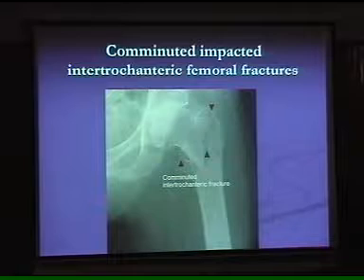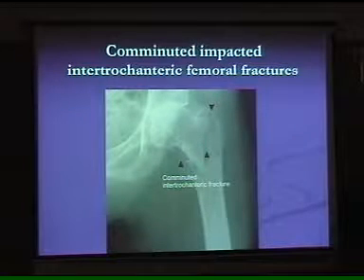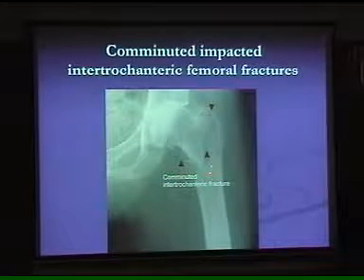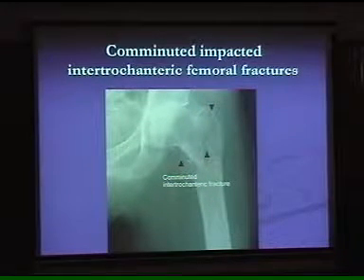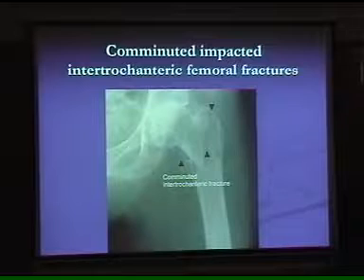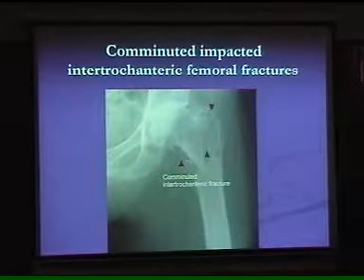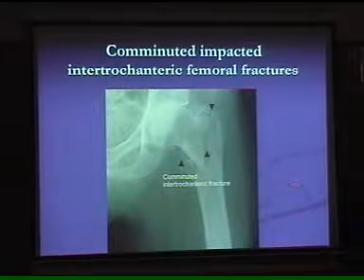If you get the whole pelvis on one big film, 14 by 17 inches, then you can compare this line. Here, the only positive finding, if you look at this carefully, is this lucent line. The main purpose of asking for a comparison film is that sometimes you may not be able to appreciate the subtle change, but if you look at the opposite side, which is healthy and normal, you can appreciate the pathology.